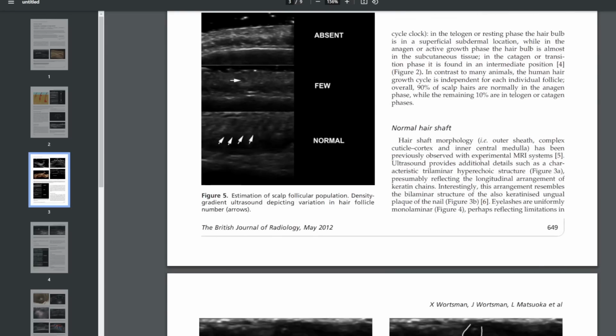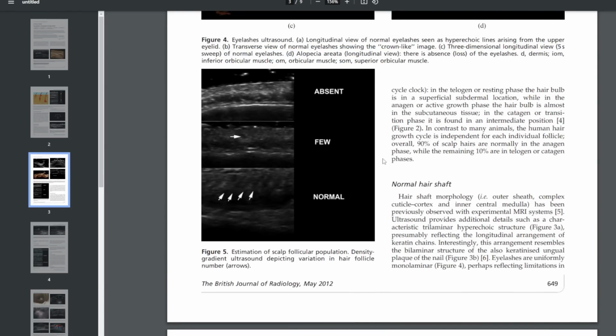And I think another cool prospect with this kind of technology is that if you're doing, let's say, a hair transplant, in the case of a diffuse alopecia, you can see the areas of the scalp where you probably don't want to transplant, where you want to be a bit more careful in transplanting.